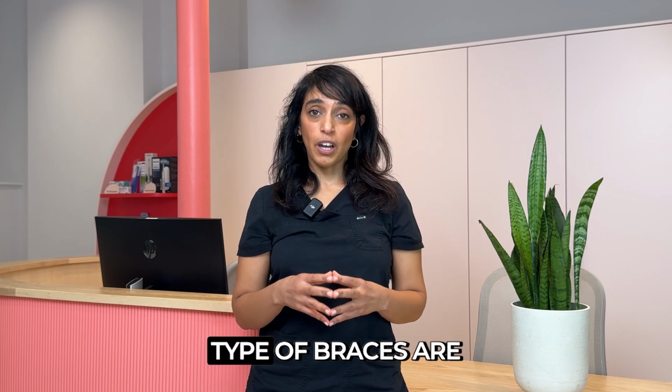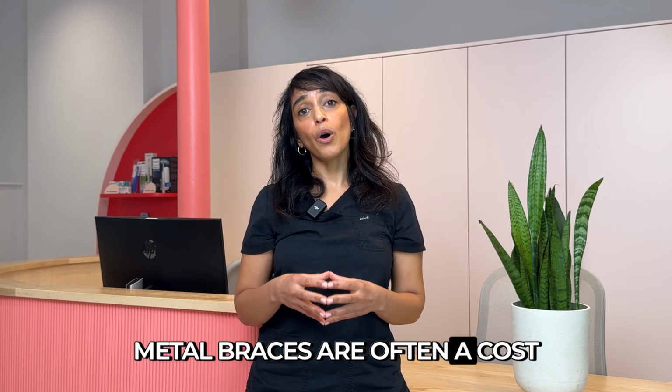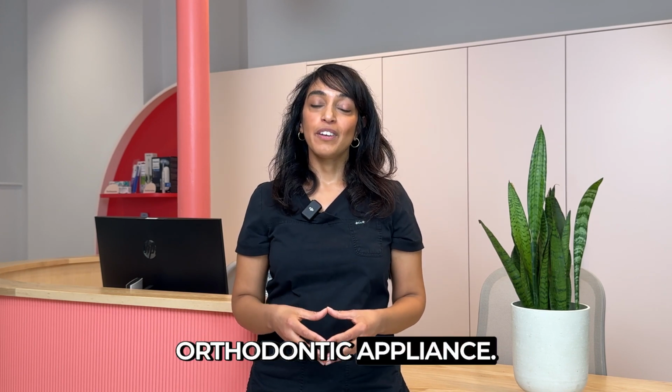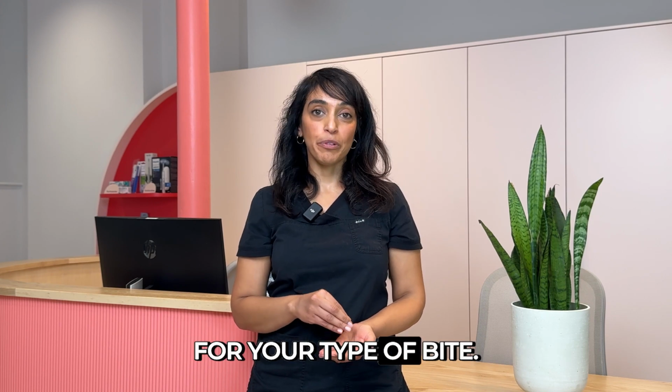The most expensive types of braces are ceramic braces and aligners. Metal braces are often a cost-effective alternative. There is no one best orthodontic appliance. The orthodontist will decide what type of appliance is suitable for your type of bite.